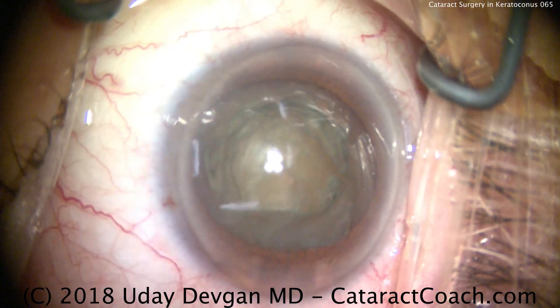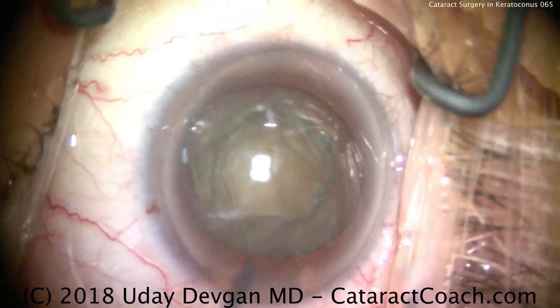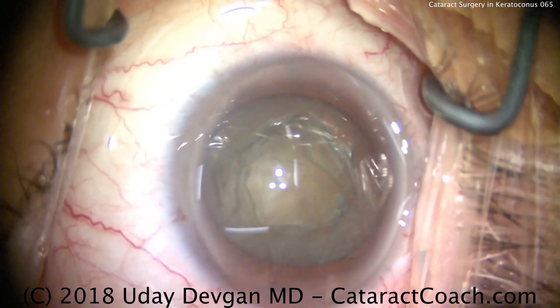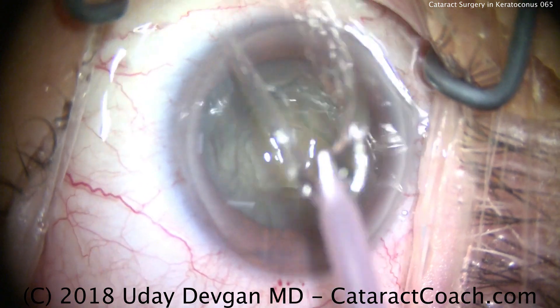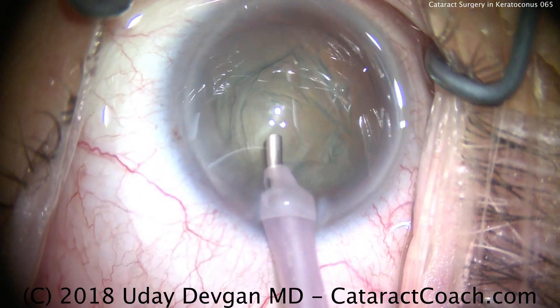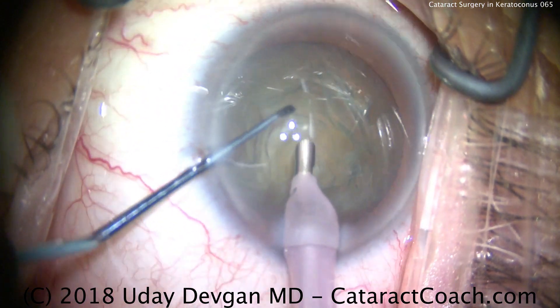Additional dispersive viscoelastic is being placed to protect the corneal endothelium. Now we're going to get our phaco probe. We're going to use a high vacuum, high flow setting — 500 mmHg, 50 cc per minute of flow, high enough infusion pressure, as well as about 70% torsional phaco power.